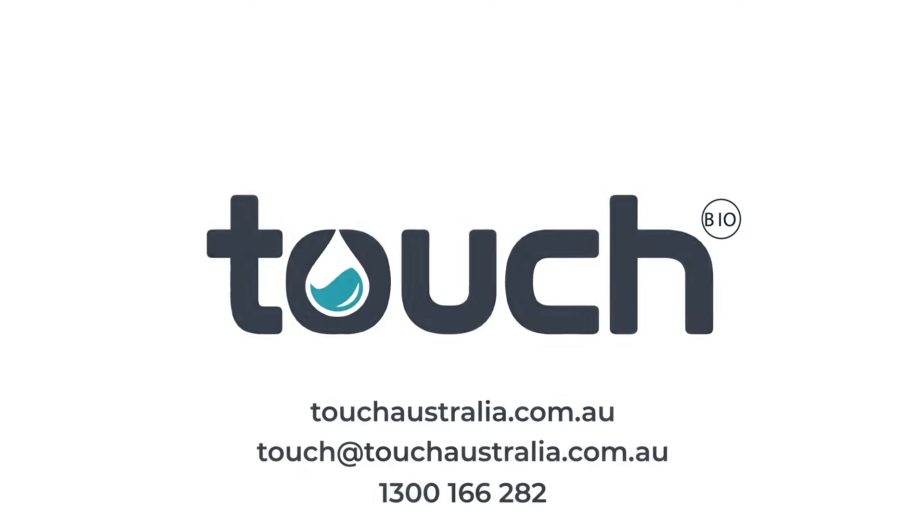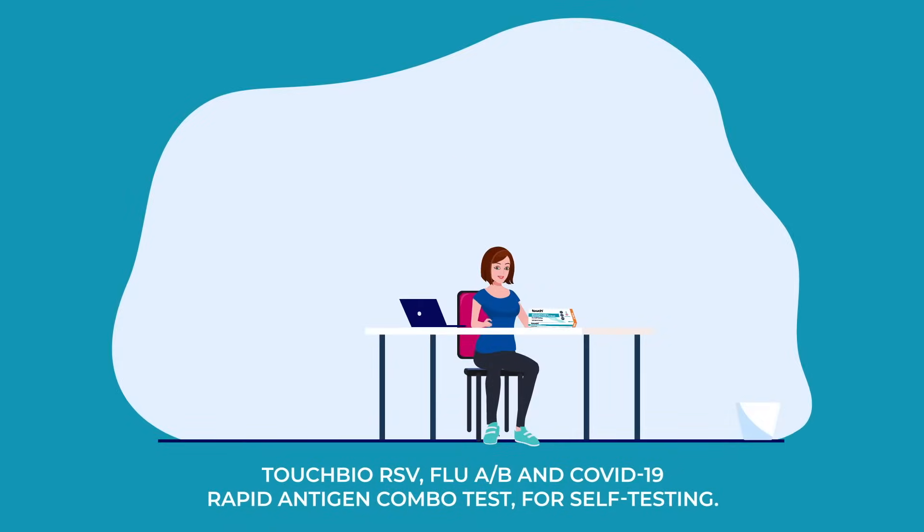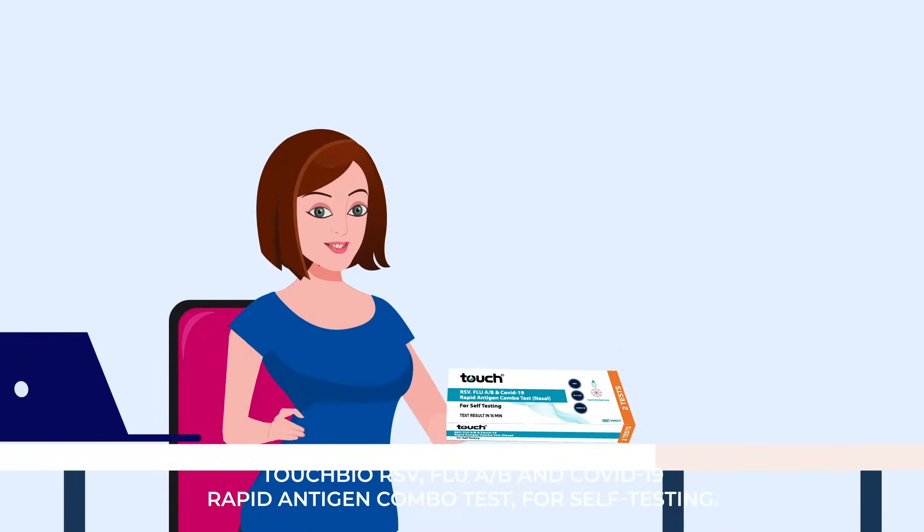Touch Bio RSV, Flu A/B and COVID-19 Rapid Antigen Combo Test for self-testing.